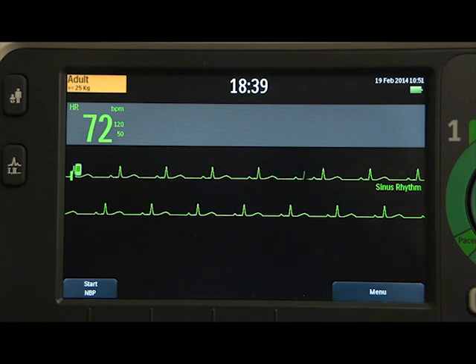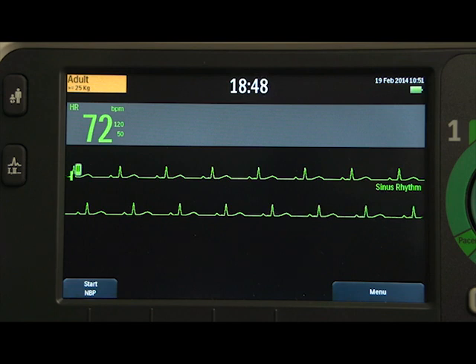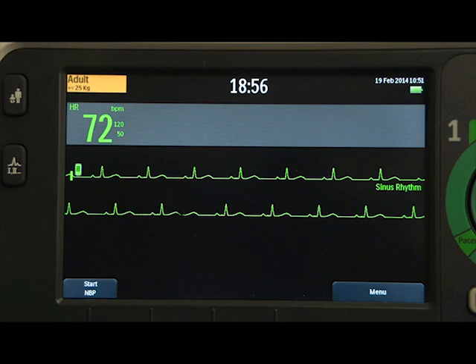When you turn on the DFM100 in Monitor, Manual Defibrillation, Synchronized Cardioversion mode, or switch into one of these modes from another mode, the default lead is displayed in Wave Sector 1. If that lead is not available or has poor ECG quality, the device automatically searches for the ECG lead with the best quality and displays that new lead in Wave Sector 1.